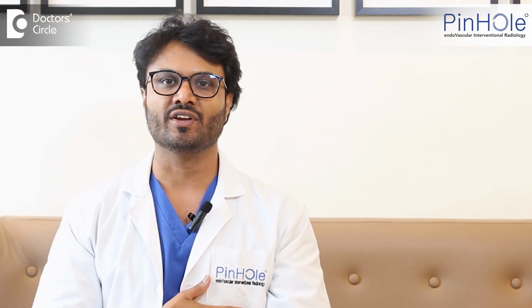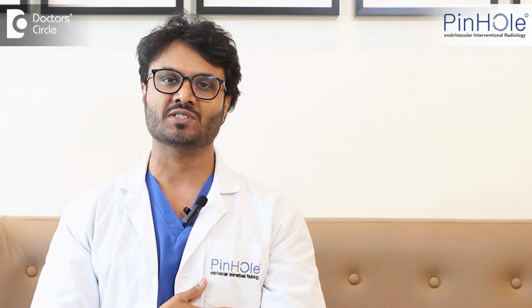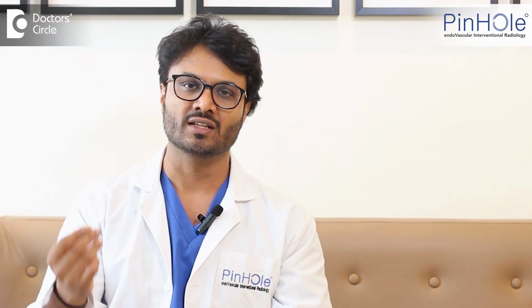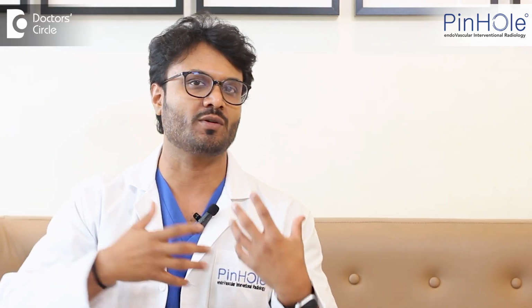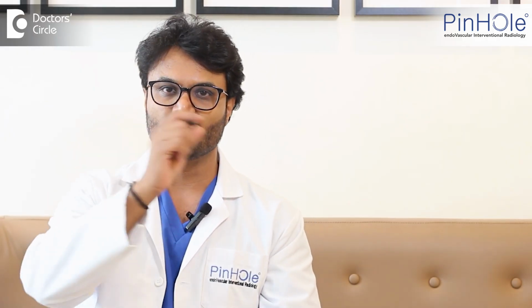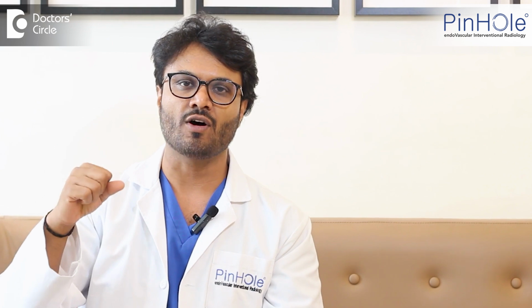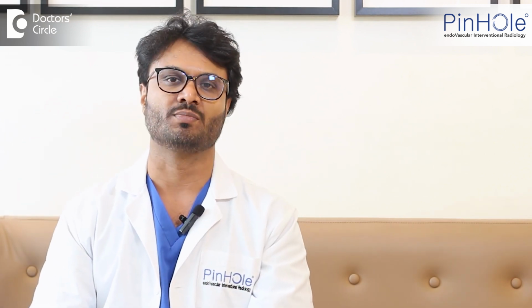Similarly, in liver, which is one of the most common biopsies that I do, when we do a biopsy, there is a chance of bleed to be more than any other lymph node biopsy or a breast biopsy. So we plug this tract. We use a special gel where this tract, where we have gone through with the needle and the area of biopsy, is plugged with the gel, and this gel forms clot formation and prevents the blood from leaking from there and causing bleeding.